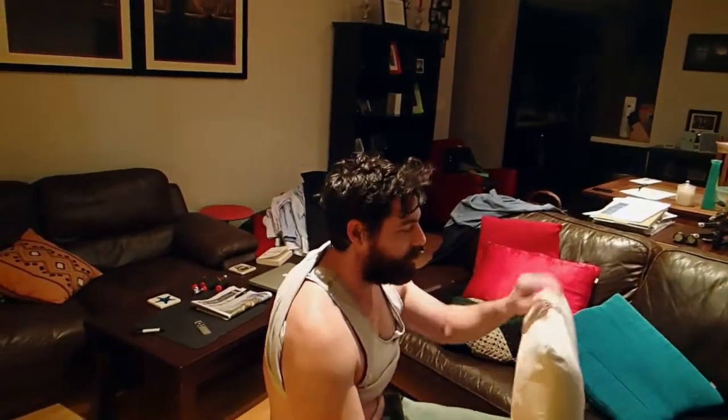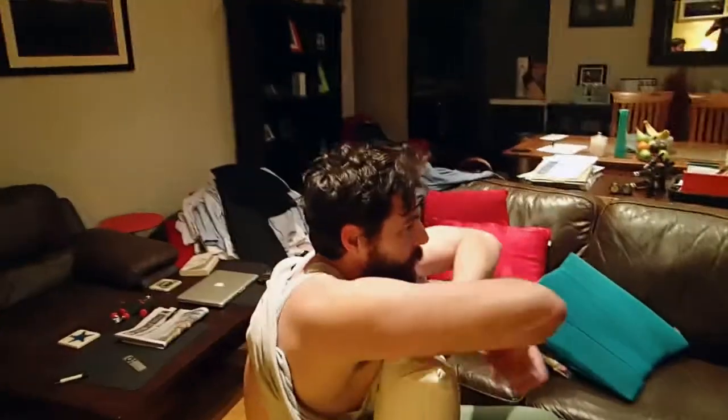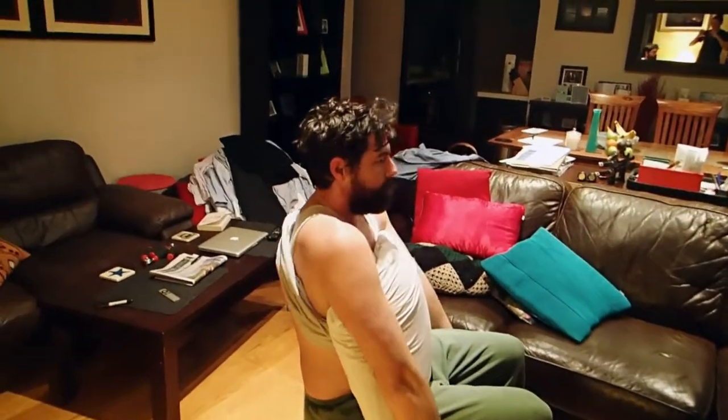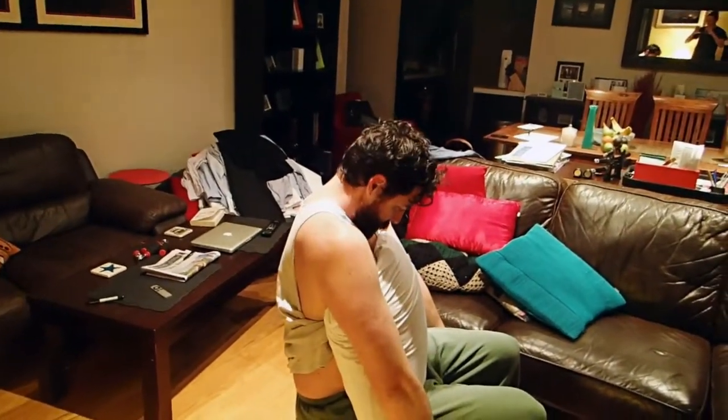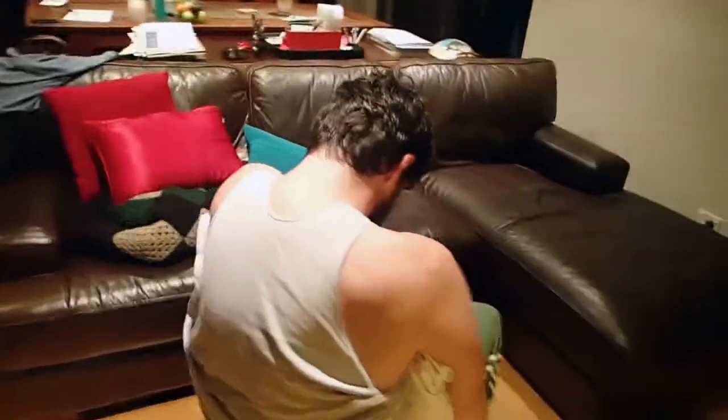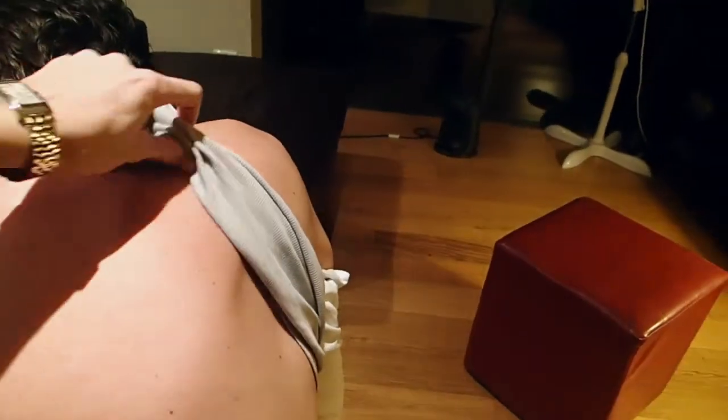I'm going to need you to put that under your arms and drop your arms over the top of it. That's good. Now, sit up straight, drop your chin to your chest, slouch your shoulders. That's good. Now, I want you to try and curl up in a ball. Now, when you do that, that's great. I'm going to push this up.